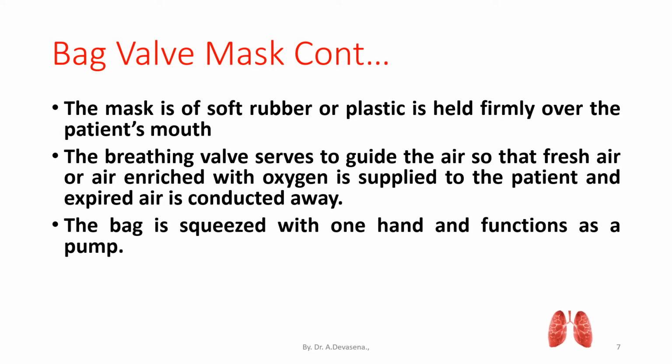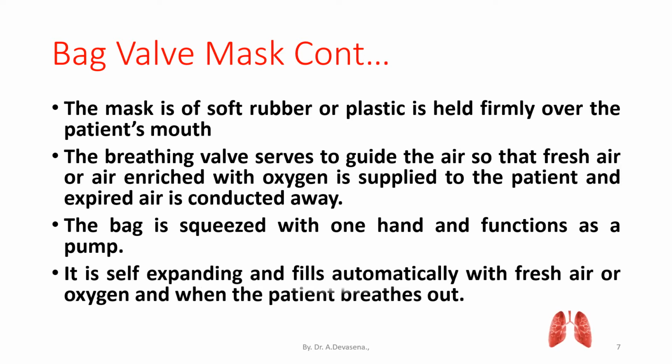The bag is squeezed with one hand and functions as a pump. It is self-expanding and fills automatically with fresh air or oxygen when the patient breathes out.